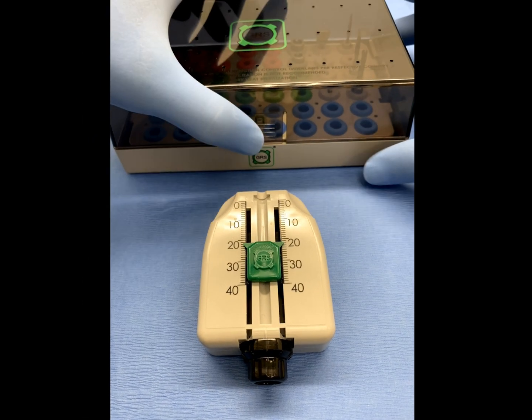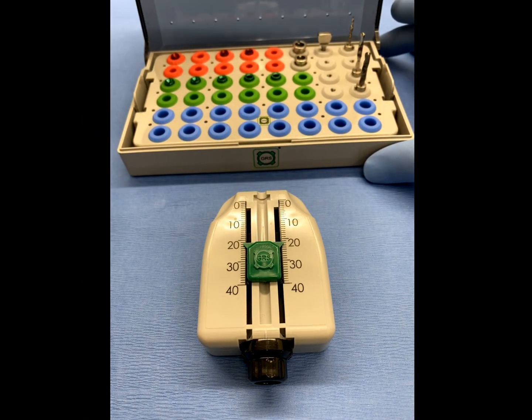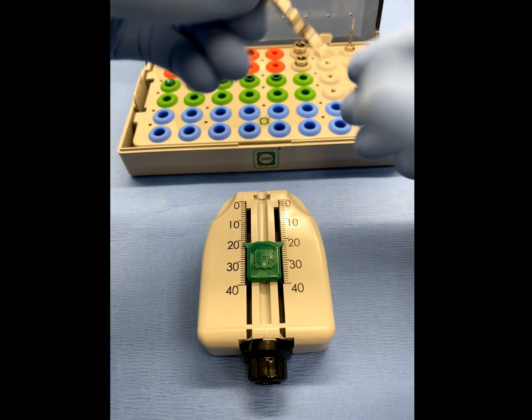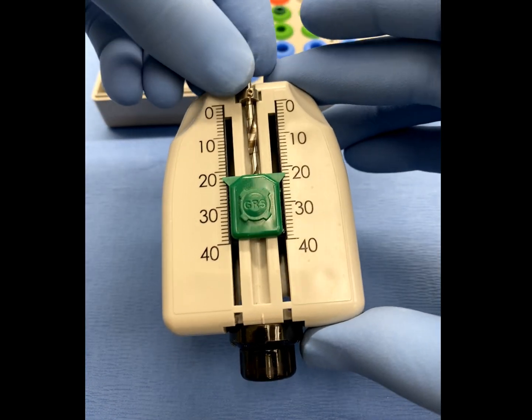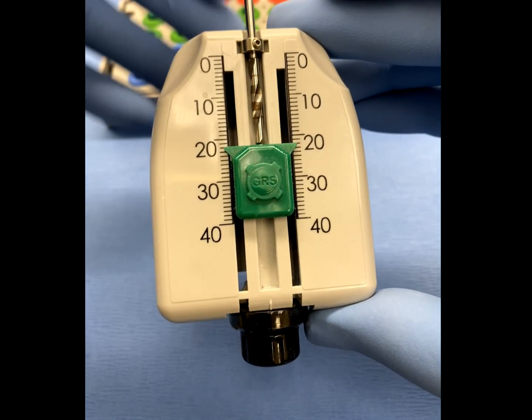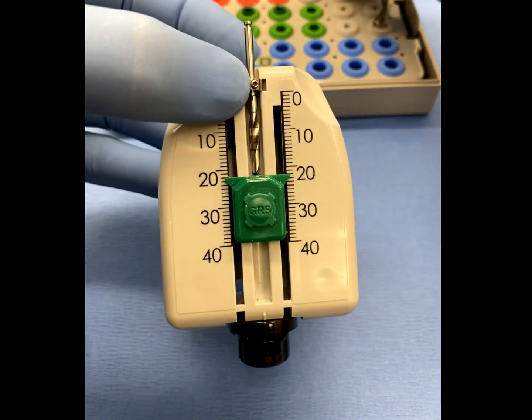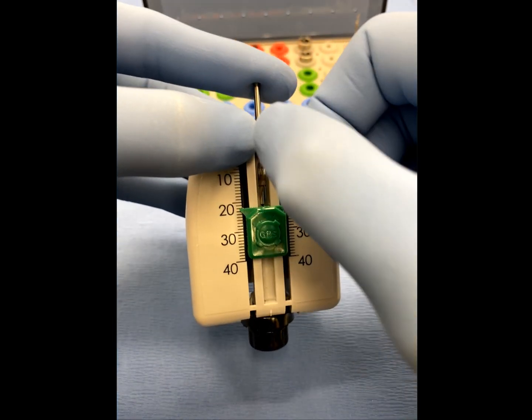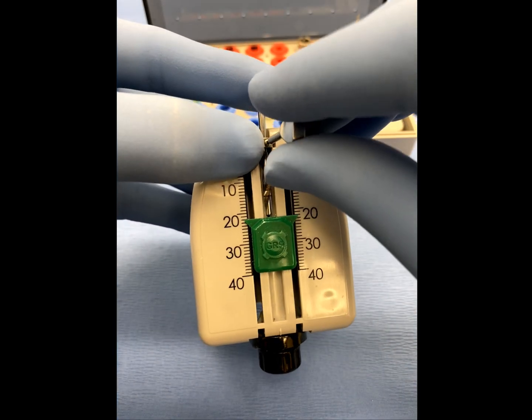The resulting measurement found on the upper shell of the depth gauge is accurate to 0.1mm and represents the exact position to affix this and all subsequent drill stops on the remaining drills of a surgical sequence in order to precisely replicate the desired osteotomy.